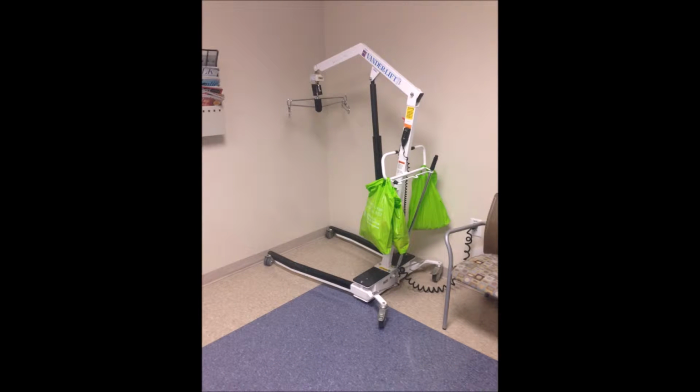Patients benefit from the use of patient lifts as opposed to manual lifting done by nurses. Patients, especially those in rehab facilities, can gain a sense of independence by being able to move themselves in and out of bed, which boosts their confidence. Also, patient lifts decrease the risk of further injury, especially for patients with severe injuries such as spinal cord injuries or complex bone fractures.